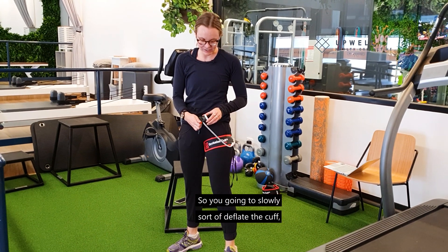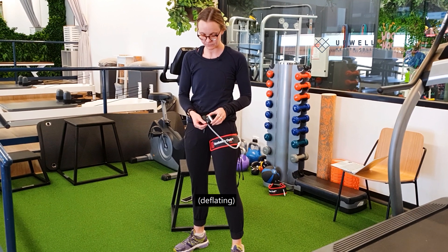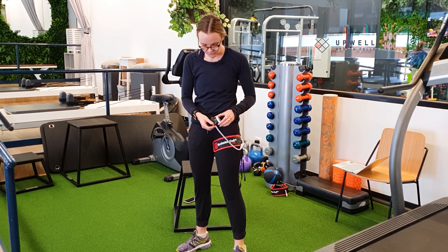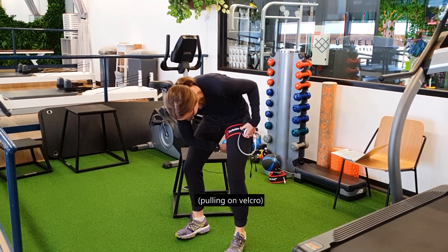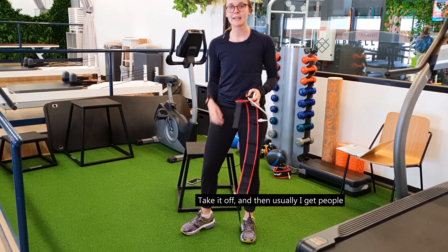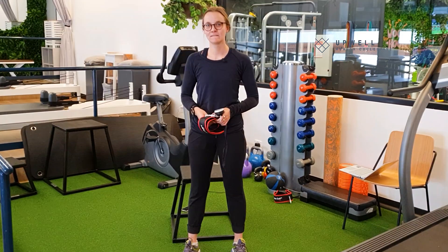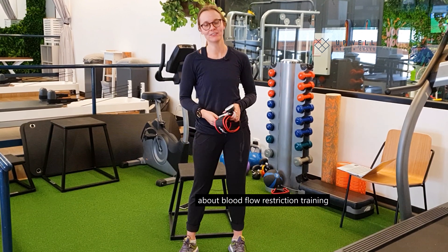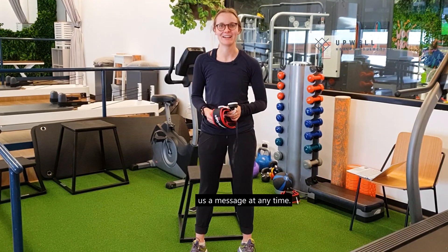You slowly deflate the cuff and just let the air out. Take it off, and then I usually get people to do a bit of a walk as well, just to get all the normal blood flow moving again. Thanks so much for tuning into our video about blood flow restriction training and the occlusion cuff. If you have any questions, please feel free to send us a message at any time.